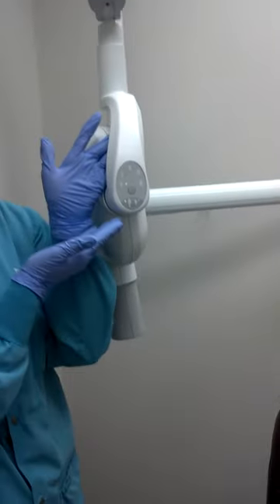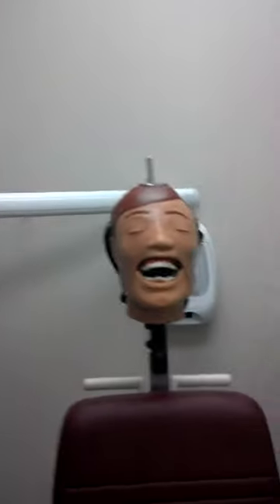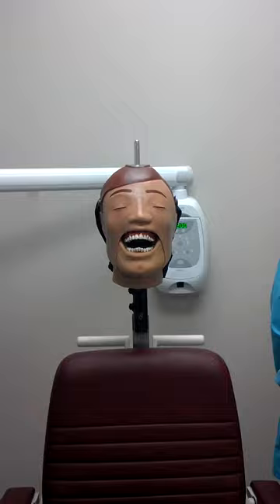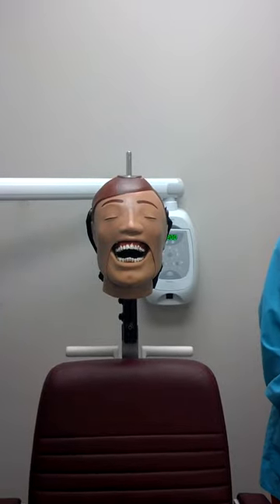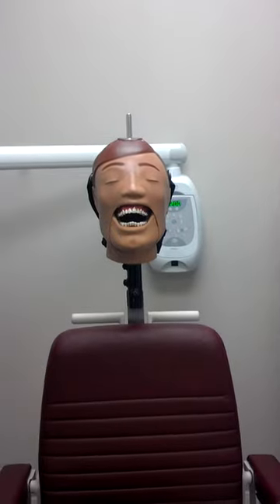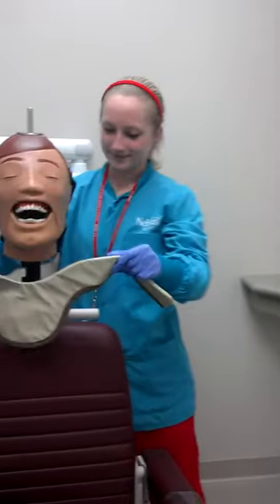Make sure the patient's headrest is aligned so that the maxillary arch is parallel to the floor, and remove any objects that may interfere, such as glasses and dentures. Take the thyroid collar and wrap it around your patient for neck protection.